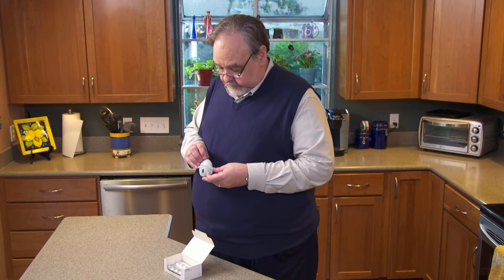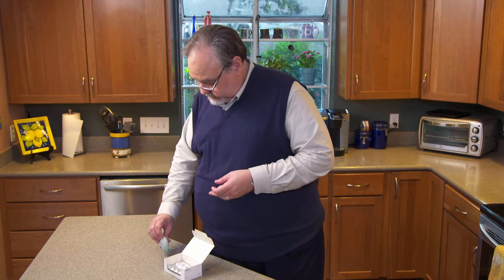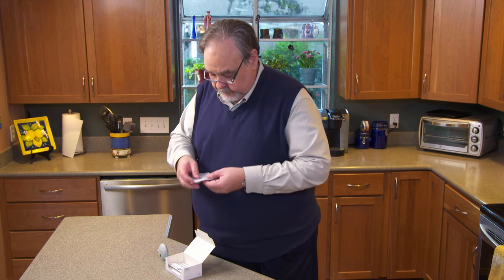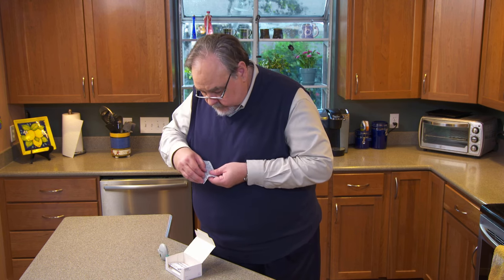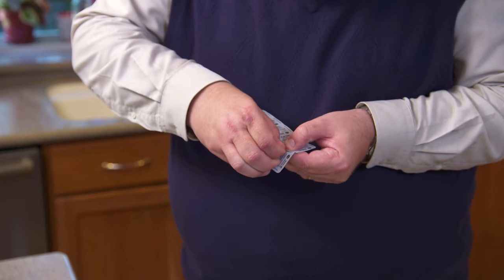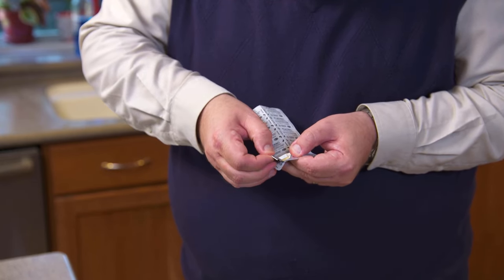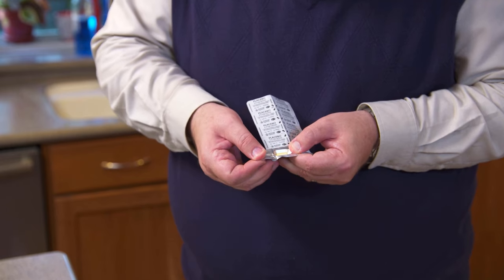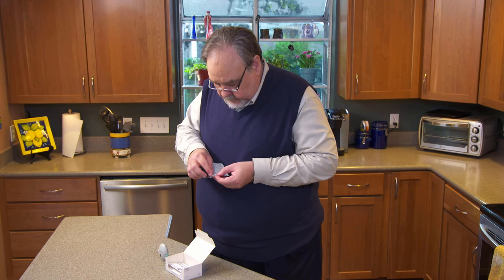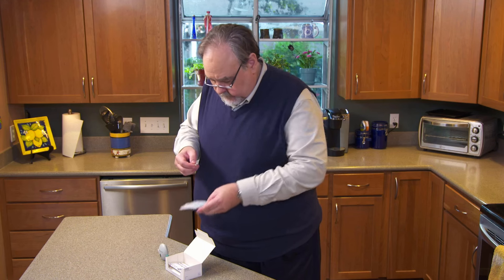To use the HandiHaler, carefully remove one capsule from the pack. Fold the foil where the arrow shows you to, and peel it back so you can take out the capsule. Don't cut the foil or use a sharp instrument to take the capsule out of the pack — that could damage the capsule. Remember, these capsules should not be swallowed. They're for use only in the HandiHaler.